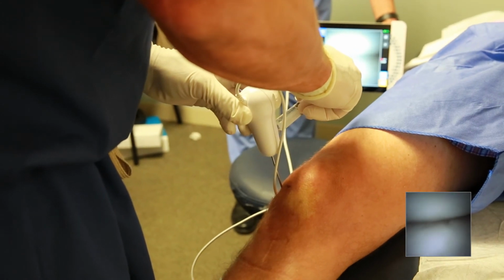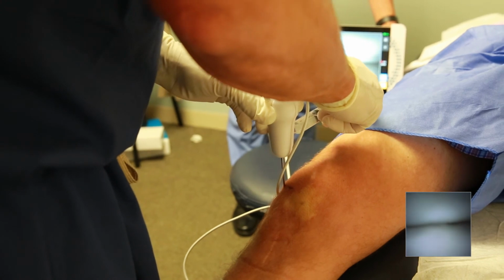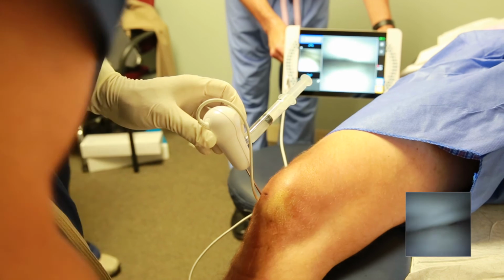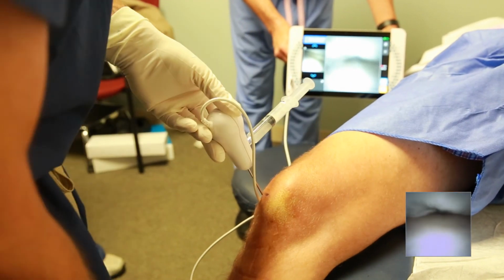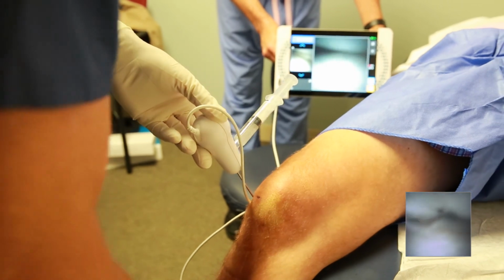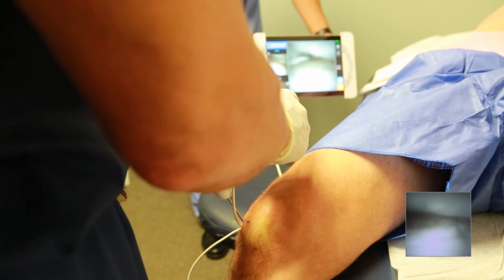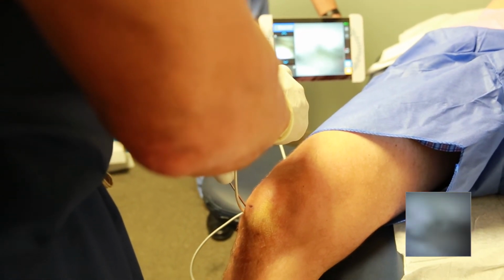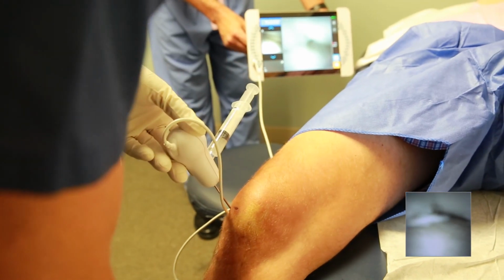So you see that little bit of cartilage change. And now you can see why he's having pain. So Jason, if you look right now as your knee's bent, there it goes from normal. That's a big-time condyle defect right there. I'm going to blow some water at it. So you're wearing out on that part of your knee.